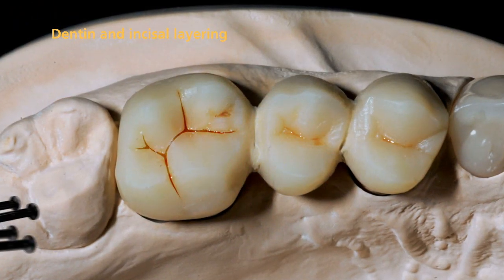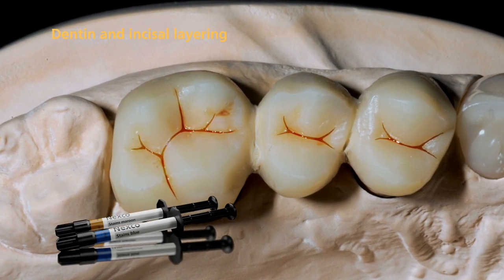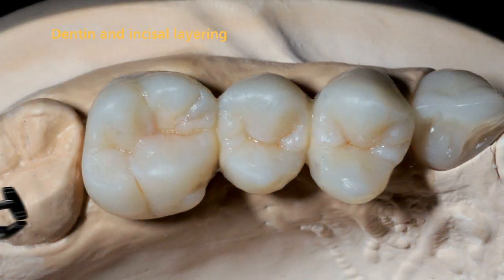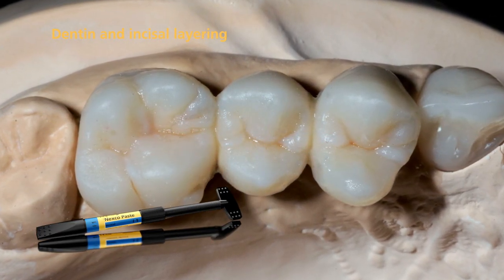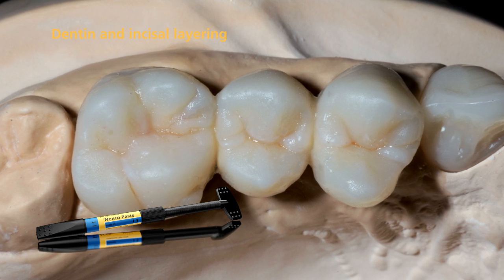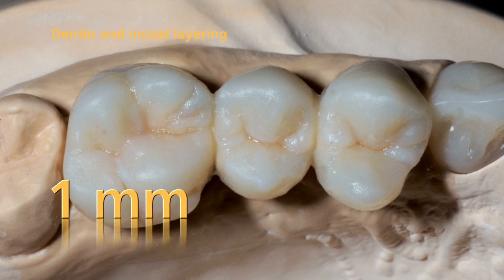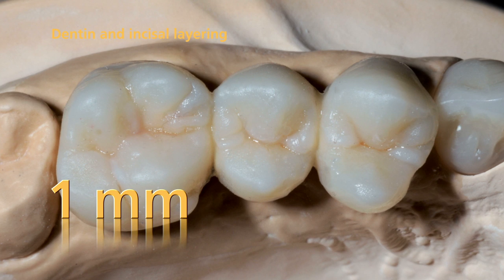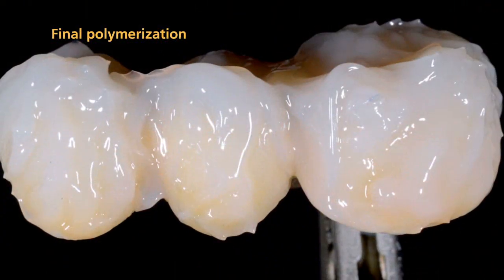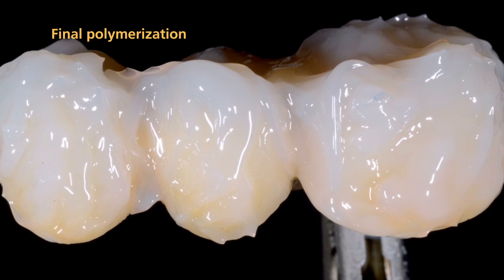SR-NEXCO stains may be applied into the fissures, if desired. Complete the incisal area step by step using incisal material. Please note that the layer thickness of the veneering material should be 1 mm to achieve an optimum shade reproduction. After the layering procedure has been completed, all areas must be pre-cured.